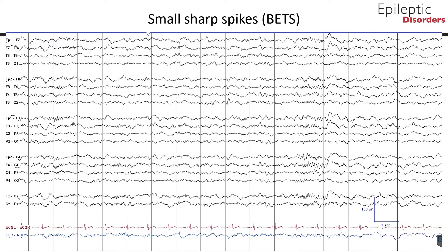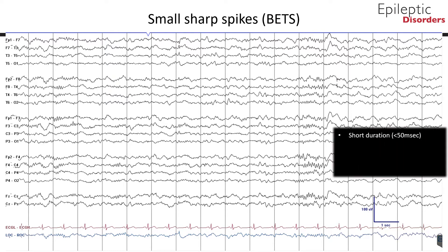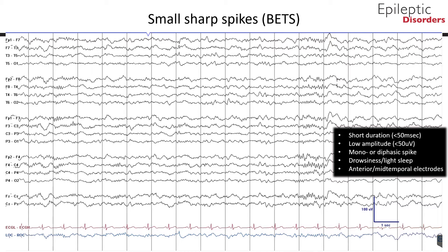Small sharp spikes, also known as benign epileptiform transients of sleep, are short in duration — less than 50 milliseconds — and low in amplitude, less than 50 microvolts. The shape is rather simple and consists of a mono- or diphasic spike with a steep descending arm, and an aftergoing slow wave is not prominent and usually is lower in amplitude than the spike component. The background activity at the region of the small sharp spike is not disrupted. These discharges are best seen in drowsiness and light sleep, and are best displayed over the anterior and mid-temporal or ear electrodes. They are mainly seen in adults. Small sharp spikes are not thought to be related to any certain disease, and are accepted as a variant of normal EEG activity.